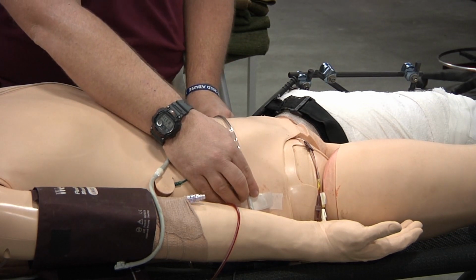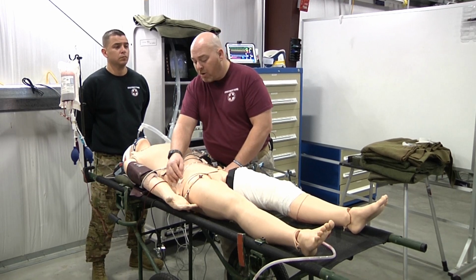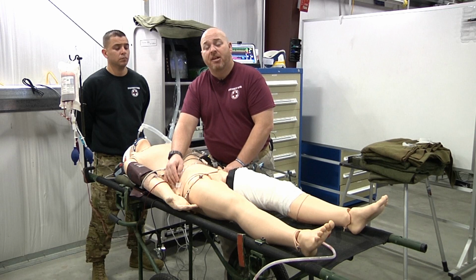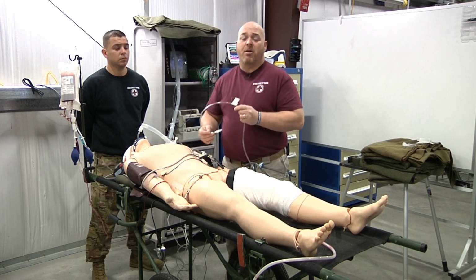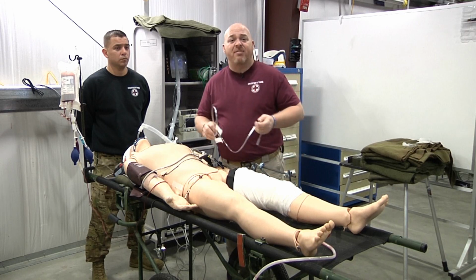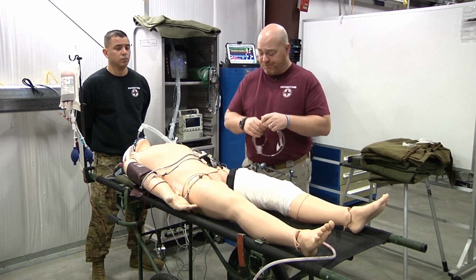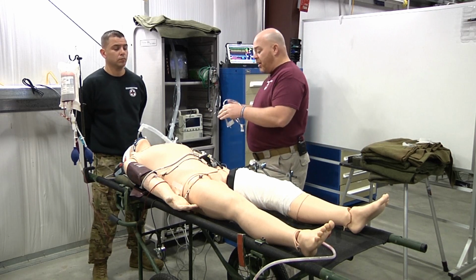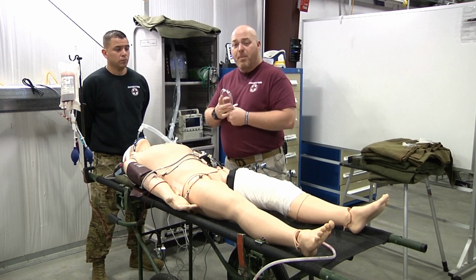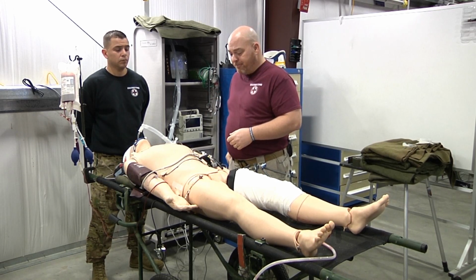In the event that we have gastric distension or maybe hemorrhage in flight, our markers will not line up because we have distension. If that happens, it's our job to identify: is that from hemorrhage or is that from gastric distension? And we can do that by assessing vital signs and other signs and symptoms of shock. It's very important to maintain this tool that you have either with the patient or on your person so that you know where it is at all times.